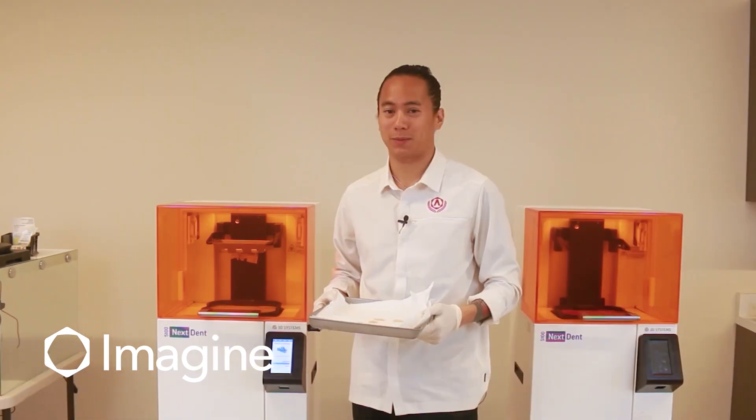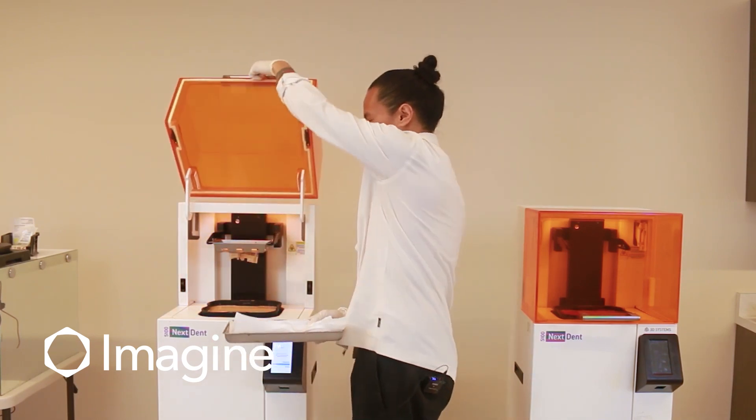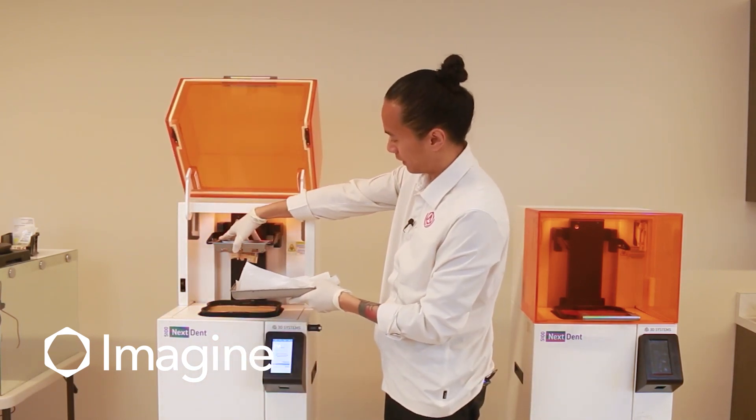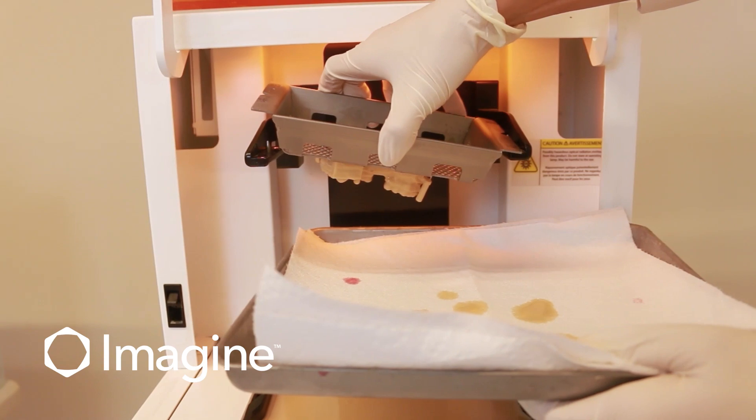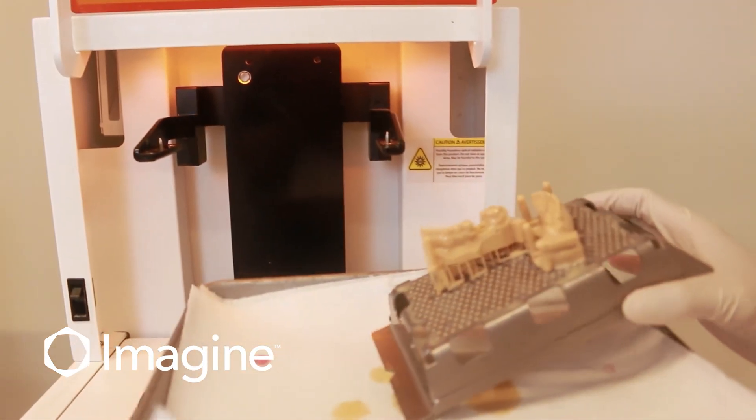We're going to do the same thing with our model bases. Again, we're going to lift the lid. I like to use a catch tray to catch any excess material. We're going to lift one corner of the build platform off first and then make sure any excess material drips onto our catch tray.